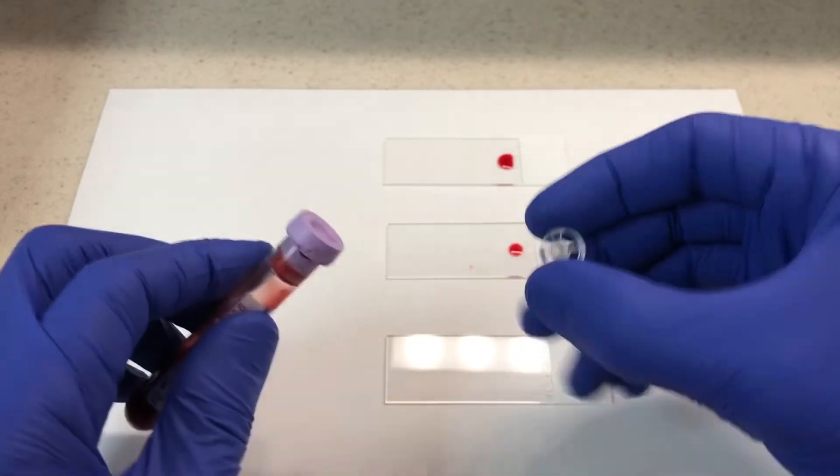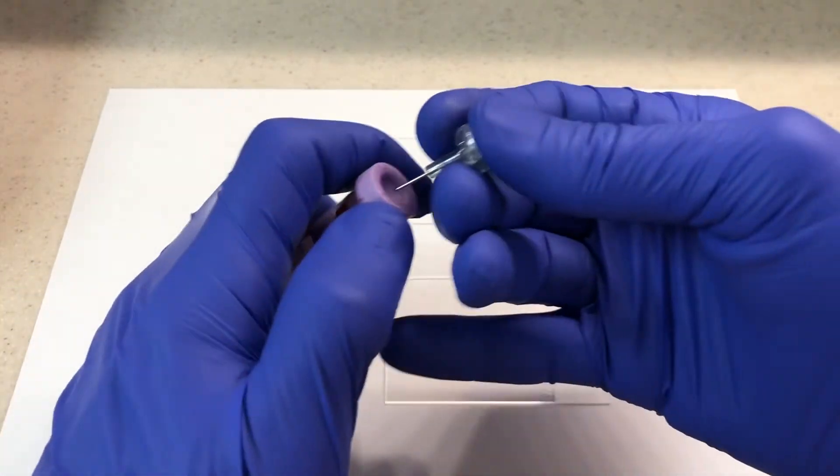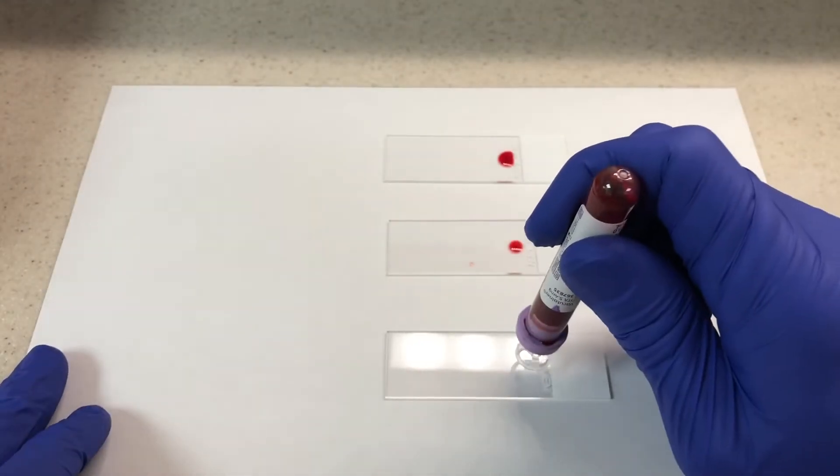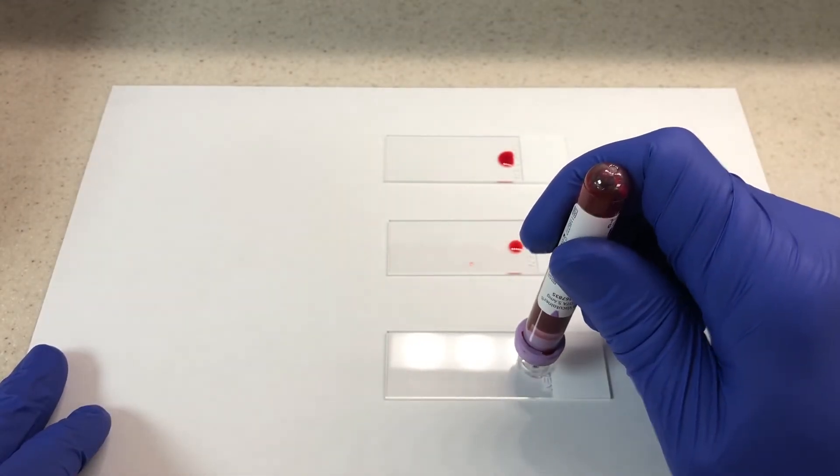And then probably the most common at least from the facilities I've worked at is a blood dispenser that just pierces through the rubber portion of the top of the tube and then pressing down you can make a drop.